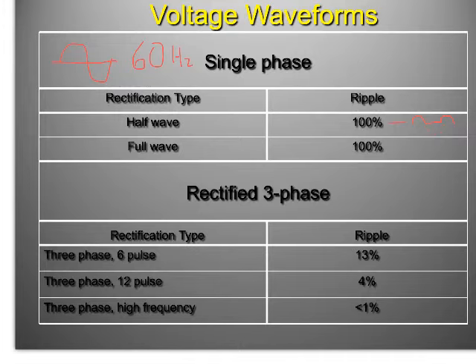It has 100% ripple. That means that from this point right here to the top of this waveform right here, all the range of energies of X-ray production are possible. Everything from 1 kiloelectron volt up to whatever I set. Let's say I set 100 kVp. If I have my machine set up like this, 60 times a second, I will produce an X-ray or a series of X-rays that have either 1 kiloelectron volt or 100 kiloelectron volts. Now that's a problem, right?